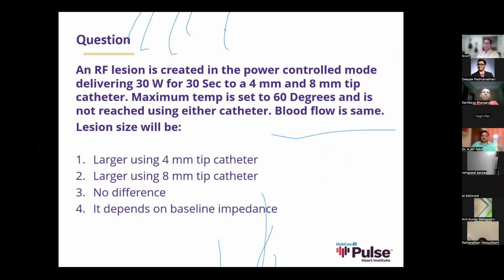But if you get the patch closer to the chest, that reduces the impedance, because the amount of tissue the current has to travel through to get out is lower. There are some papers showing that when ablating in the terminal CS or AIV, they put a grounding patch on the chest. That reduces the overall impedance in the system, and then you can burn.